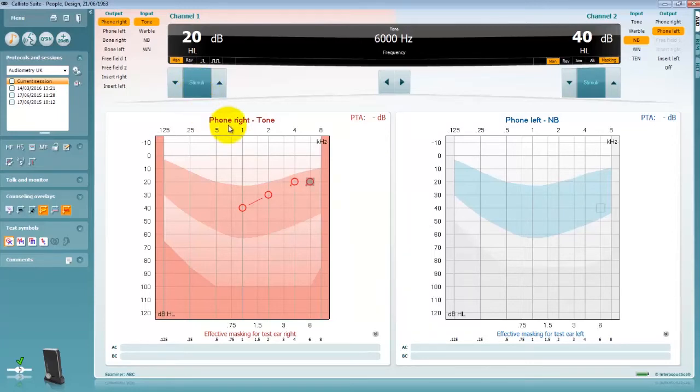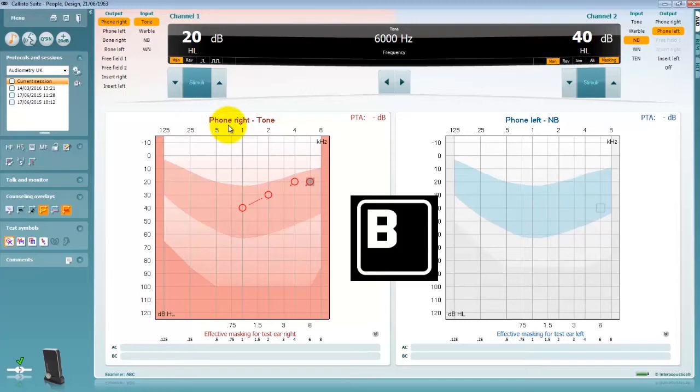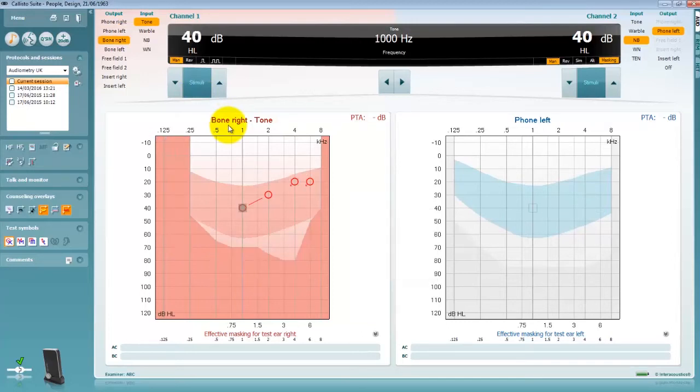To begin performing bone conduction testing you can press the B shortcut key to change to the bone transducer or click on the BC transducer from your output list.